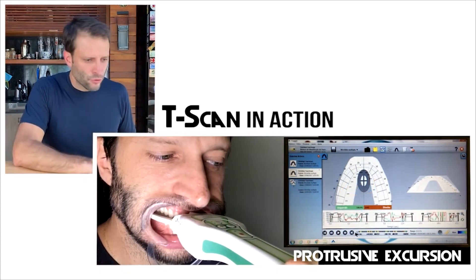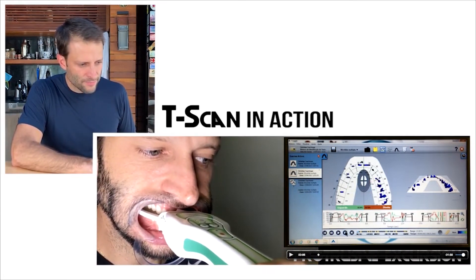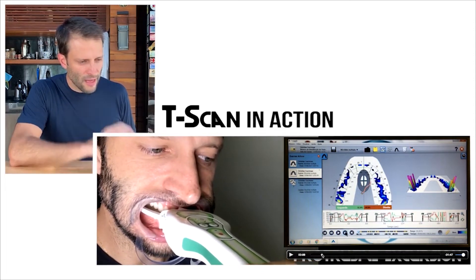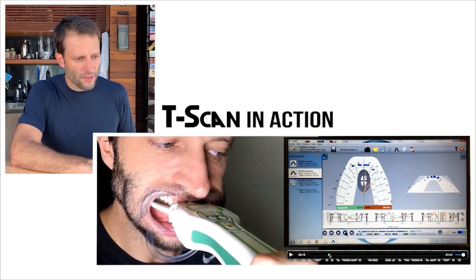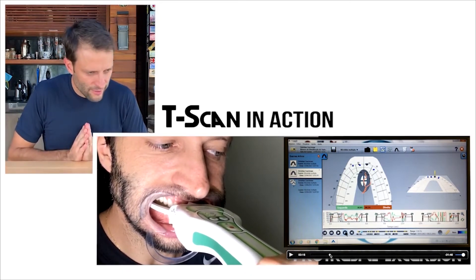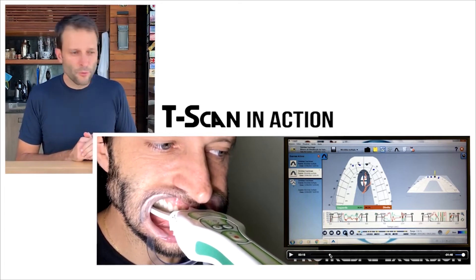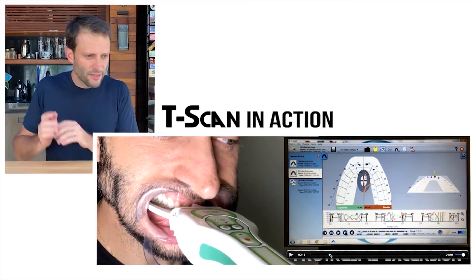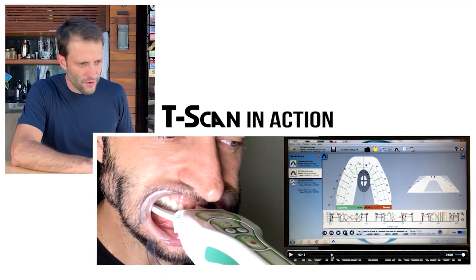Let's see my protrusion. As I'm biting together and sliding forward, you can see I'm touching beautifully — I have a nice protrusion. Even if I don't have a nice canine guidance, at least the protrusive movement is pretty good. As I'm sliding forward, the load is distributed among my four anterior teeth, which is very nice.